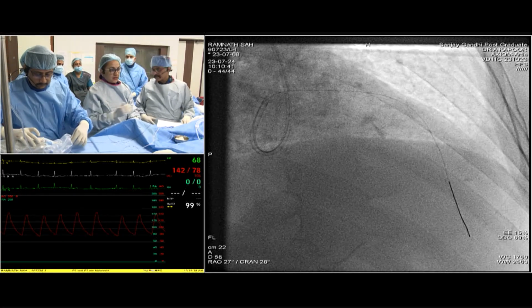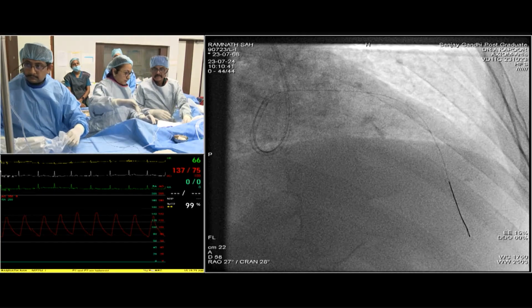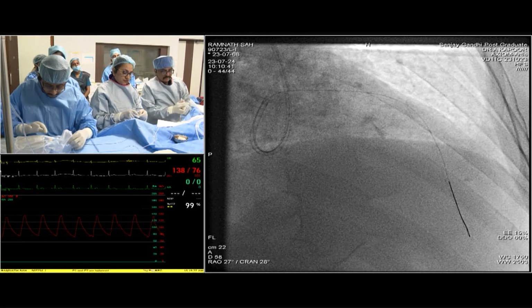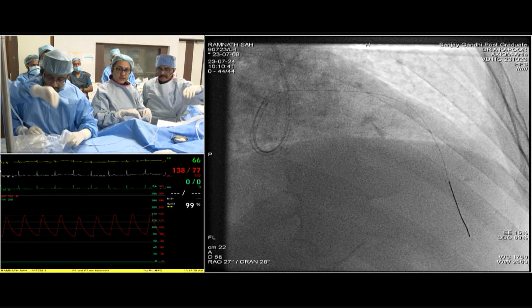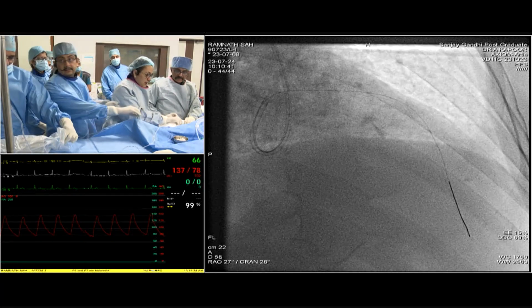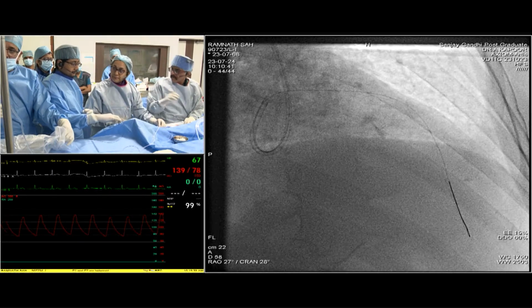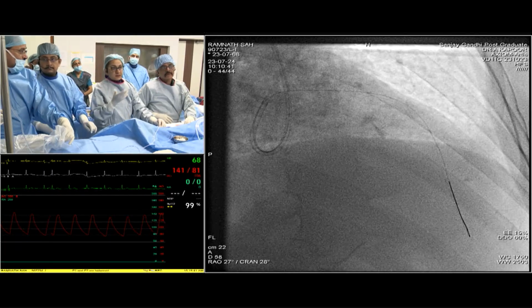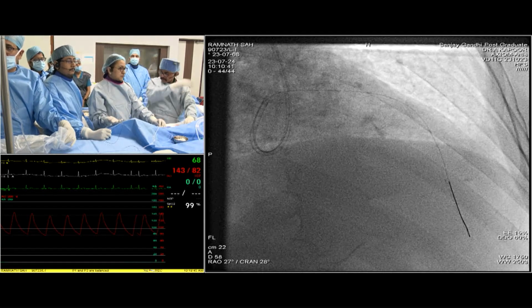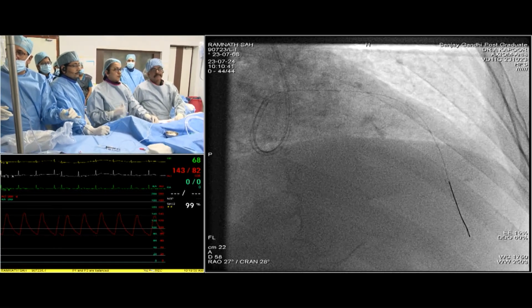We now have very good data from the Indian population, which has shown that the lesion can be due to plaque erosion, plaque rupture, or a calcified nodule. Different morphologies have been seen with STEMI and non-STEMI, and plaque erosion has been found to be more common in the non-STEMI group. Not in our case, but if you have plaque erosion with good lumen area, some studies like the EROSION trial have shown that you can keep it on medical follow-up. We don't have to stent these cases.